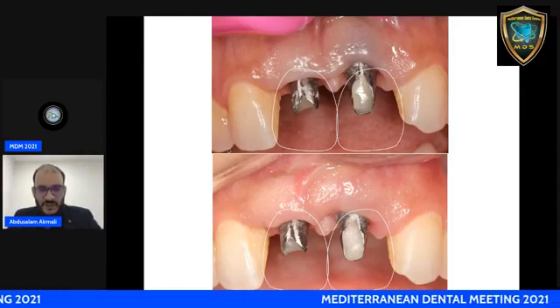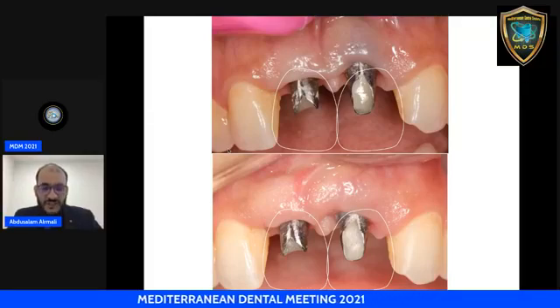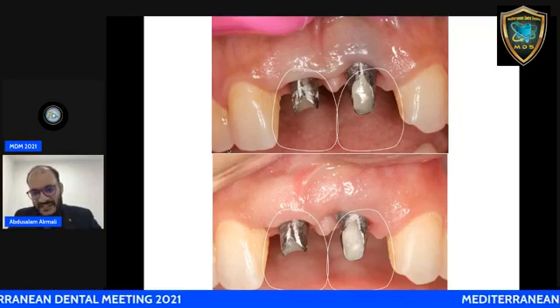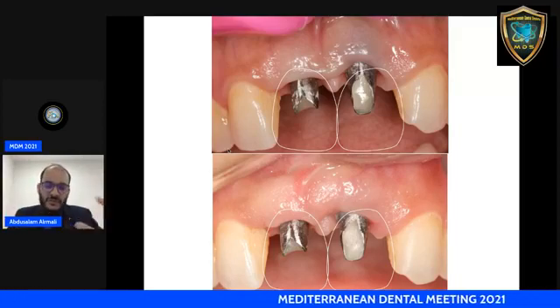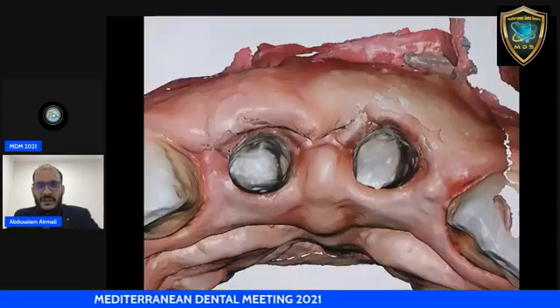We hide the shadow, improving the interproximal, improving the height, trying to place a short crown on the left side to give the chance for the soft tissue to creep, and the right side needs some conditioning to optimize the aesthetic result. We did an intraoral scan.